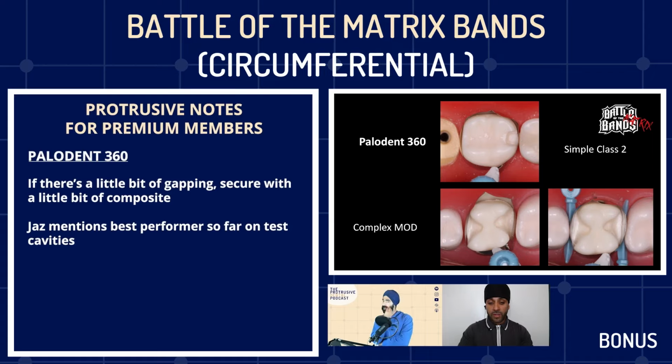Exactly. For a simple class two, I think you probably might get away with not using a wedge, but in this situation, you're certainly going to need to. But of course, there are no free rides, right? There are always downsides to every system.